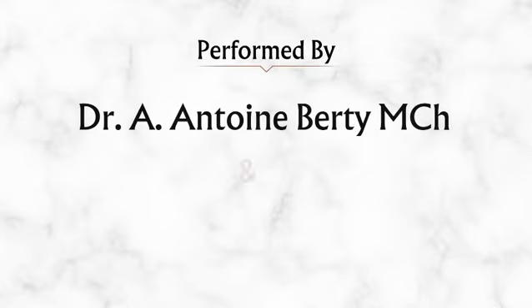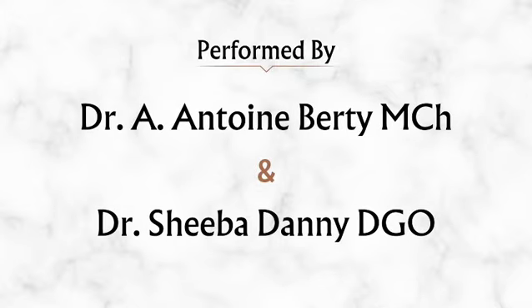In this video we shall learn about laparoscopic caesarean scar pregnancy, CSP. We are about to see the laparoscopic management of a caesarean scar pregnancy, one of the rare but serious variants of ectopic gestation.